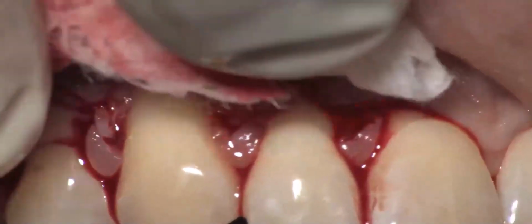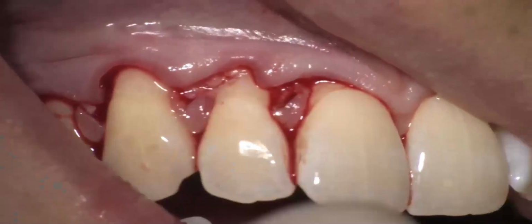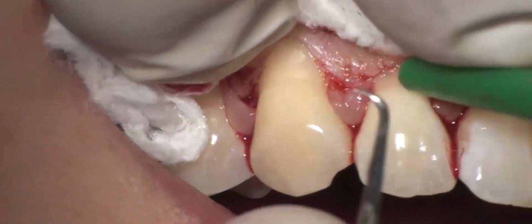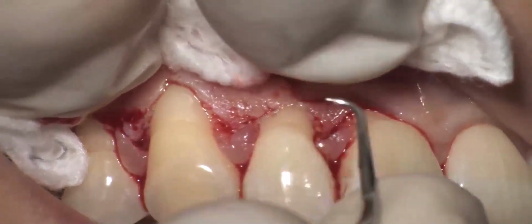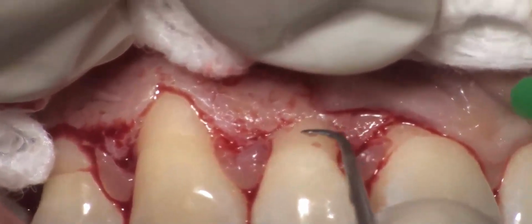Okay, now we go to the lateral, which is the last tooth to be treated. Change the gauze again. Isolate the root with the fingers and the gauze and make root planing.